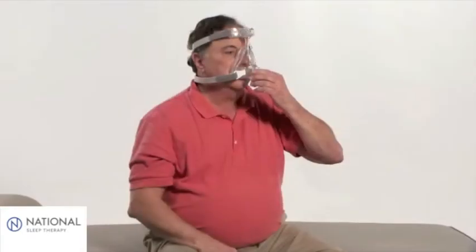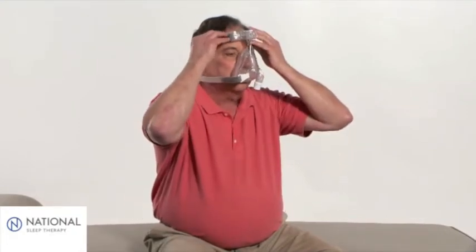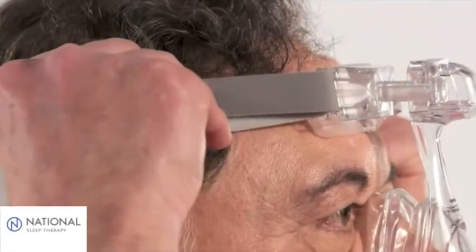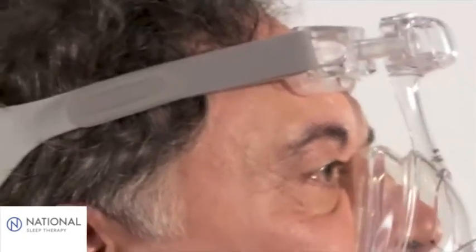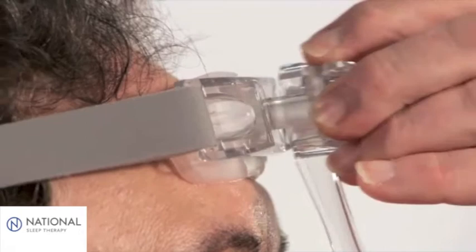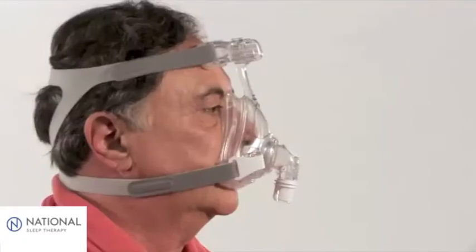You're now ready to make initial adjustments, which should be made while you're sitting up. Pull back the tabs to evenly adjust the top and bottom straps. Be sure that they are tightened evenly and the forehead pad is lightly touching the forehead. If needed, press and hold the button on the fine glide adjuster to decrease or increase the pressure on the bridge of your nose and chin.